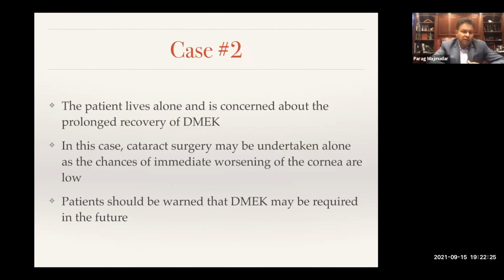And let's just do the cataract surgery, get you functioning a little better. This patient's vision was 20/60, 20/80. If I get her to even 20/30, with a little glare from the mild few guttae that she has, I think she'd be much more functional and she'd probably be happy with that. And so we gave her the option. I said, I'm happy to do both. I think you do have a little bit of cornea issues, but here the primary consideration for me was cataract.